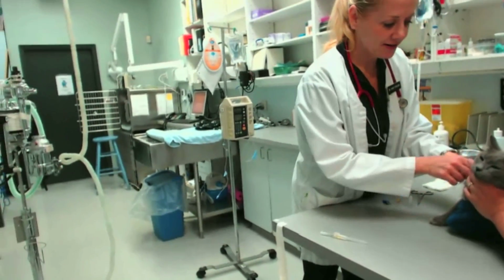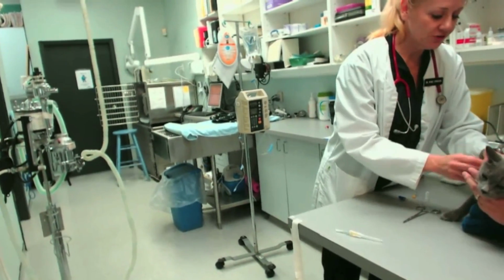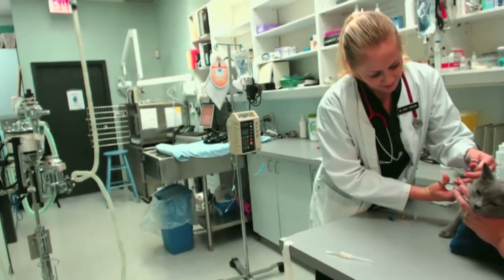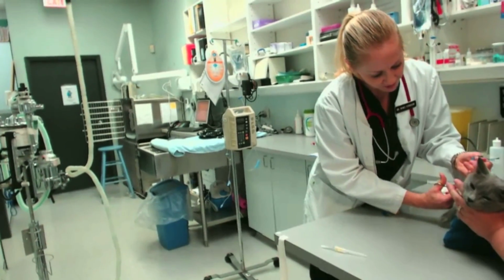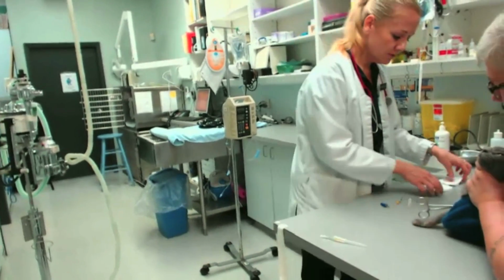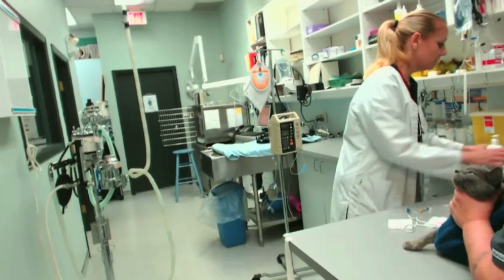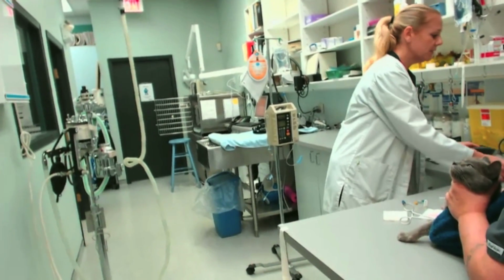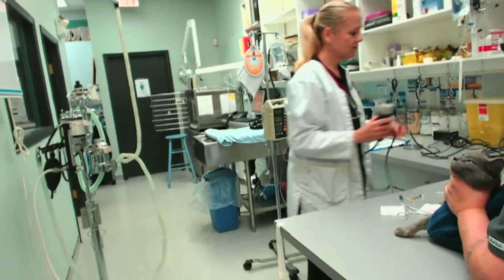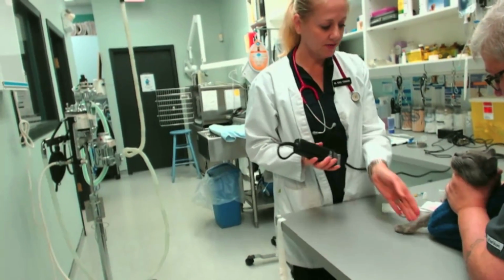So we put in an intravenous catheter for a couple of reasons. One is she's not going to be drinking very much today, so it's just a way of giving her more fluids. The other is if we need to give her any medication while she's sleeping, we have a vein that's already open and we can just give medications. And also, if her blood pressure isn't exactly where we want it while she's sleeping, it allows us to adjust her fluids, and we can make sure that we have her blood pressure exactly where, or hopefully exactly where we want it. So it's a safety precaution, and it's also a nice thing to not be dehydrated.